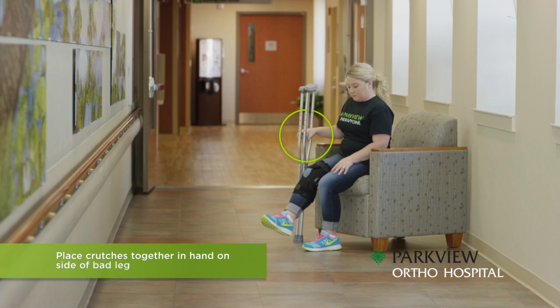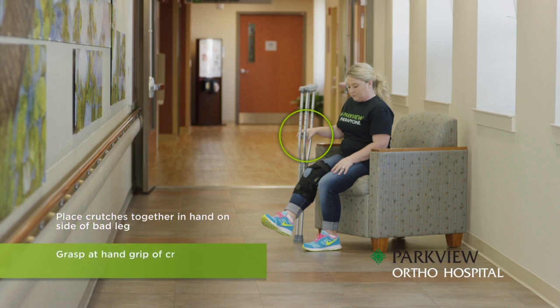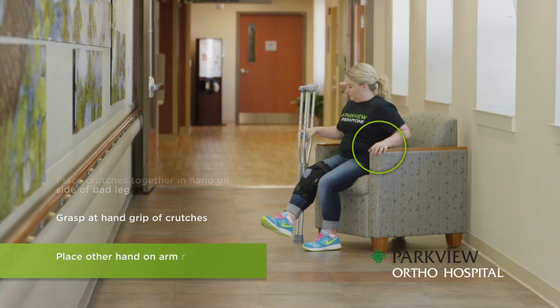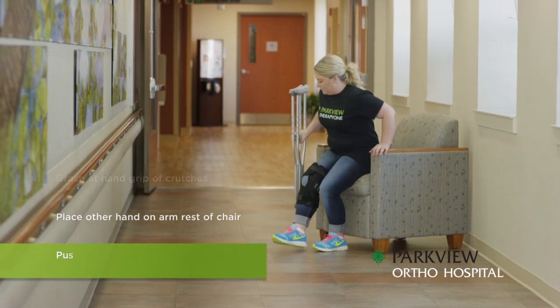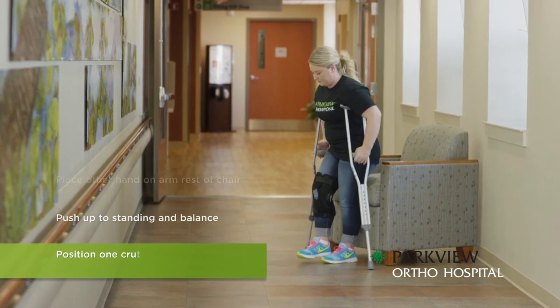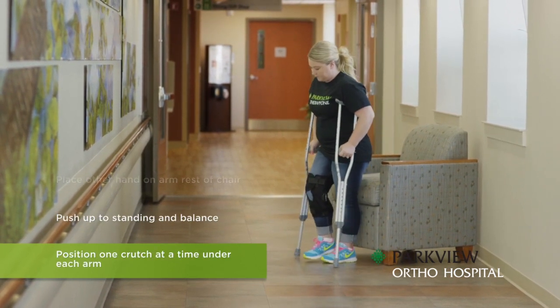To stand, place the crutches together in your hand on the side of the bad leg and grasp the hand grips of the crutches. Place your other hand on the armrest of the chair. Keeping your bad leg off the floor at all times, push up to standing and gain your balance. Once balanced, position one crutch at a time under each arm.